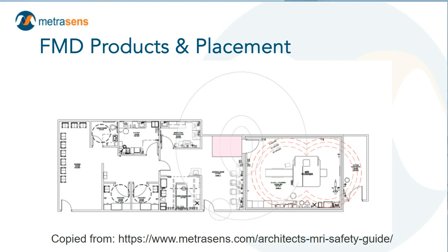There are 3 sort of standard locations and 2 different ferromagnetic detection formats that I want you to consider for each project. There's the doorway systems that most MRI suites that have ferromagnetic detection put the doorway detector system on. And this is vitally important.